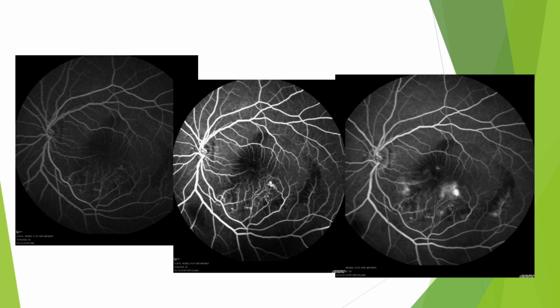Do you see filling of veins in that? Whether the veins are filled or not? The first image, whether veins are filled or not? Yes or no? Yes. So it's what phase?